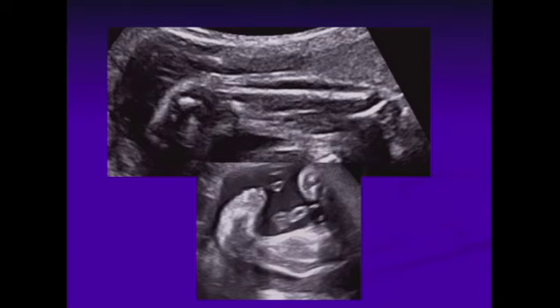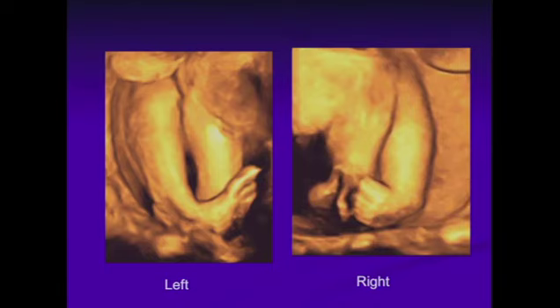Here are two more examples of club feet. Now, some people really like 3D ultrasound to demonstrate these abnormalities, but again, you have to first see it in 2D to understand that the abnormality is actually present before these 3D reconstructions can really be helpful.